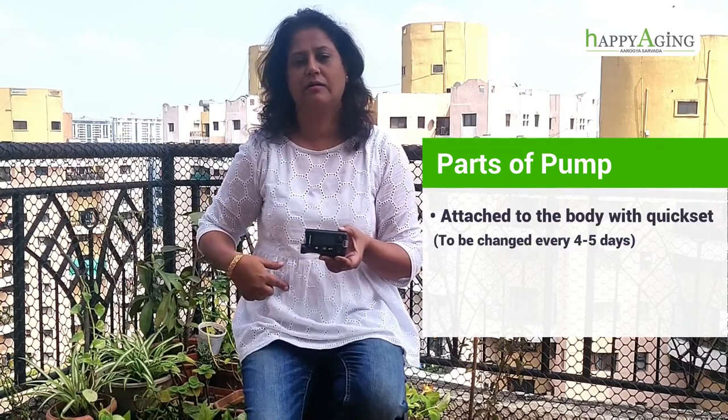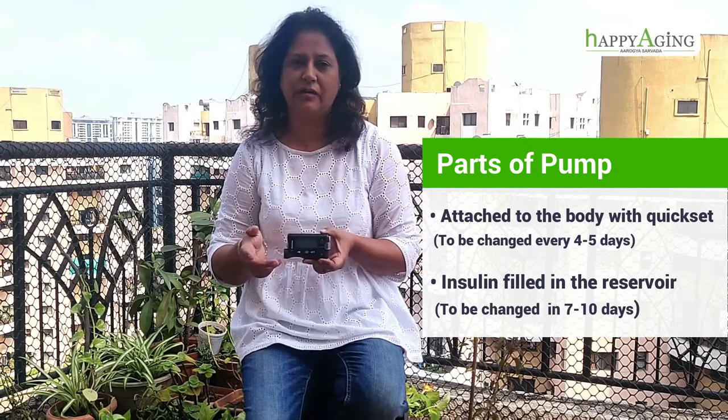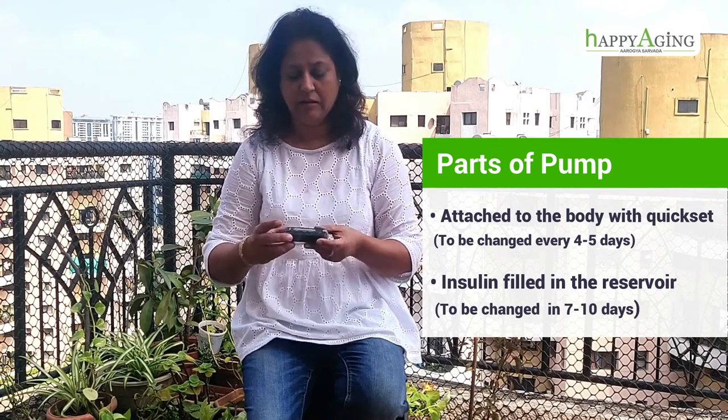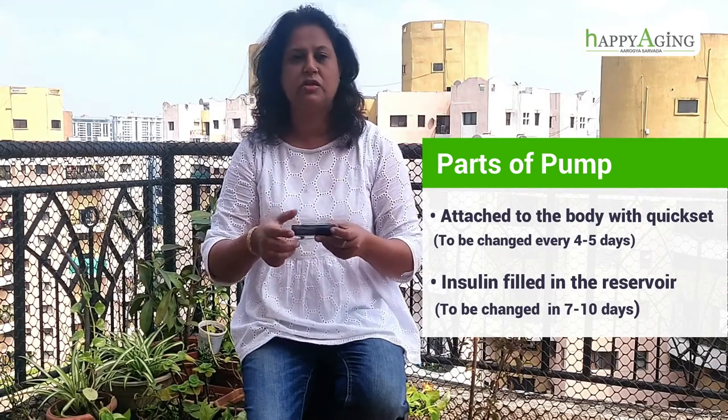You can feed how much insulin has to go into your body. If I talk about the parts of the pump, this is attached to your body with a quickset — similar to an IV in hospitals. We have to change that in 4 to 5 days. The insulin is filled in the reservoir, and this also needs to be changed in the next 1 week or 10 days. This works on a triple A battery.